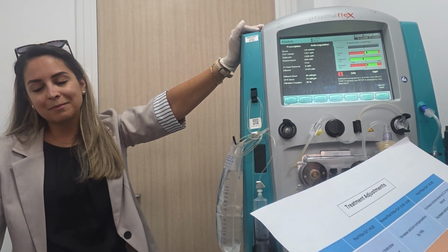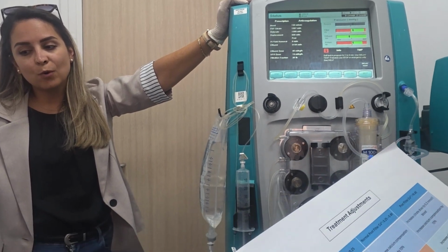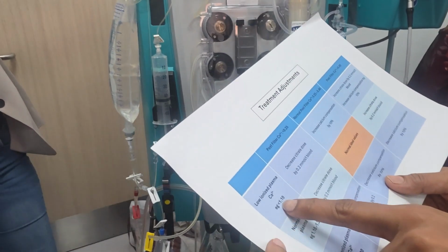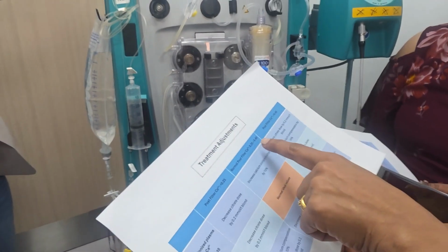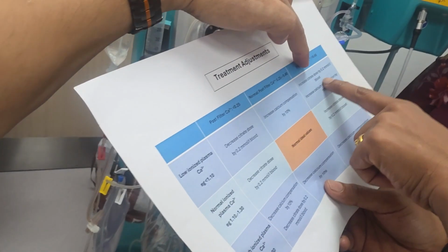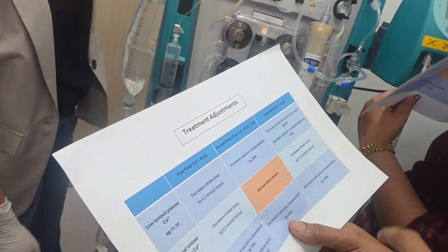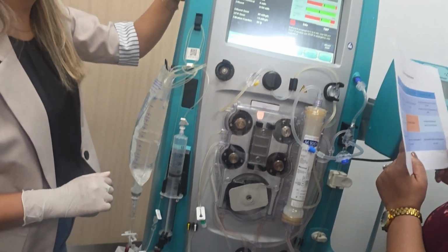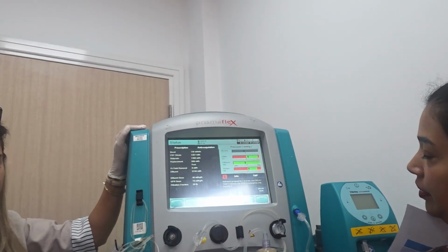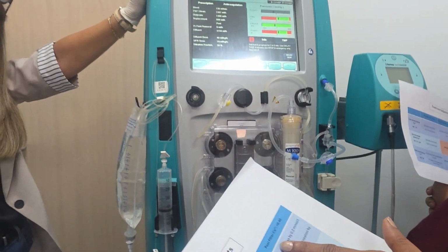So now another ABG. Patient side now 0.9, low. Machine side 0.5, high. Increase citrate dose, filter post 0.2, and increase calcium by 10%. Increase calcium compensation by 10%. So both 10%. Let's wait for 1 minute until we finish the self-test. Increase citrate and increase the calcium.